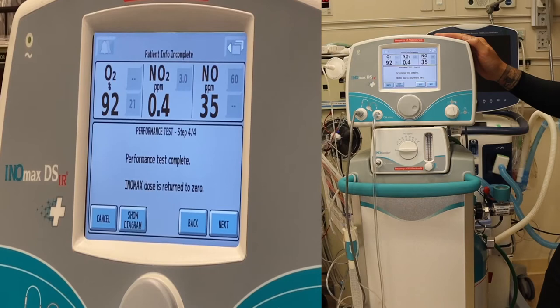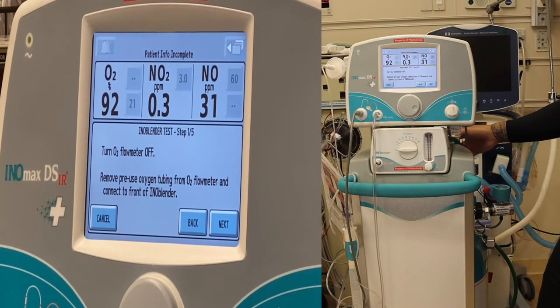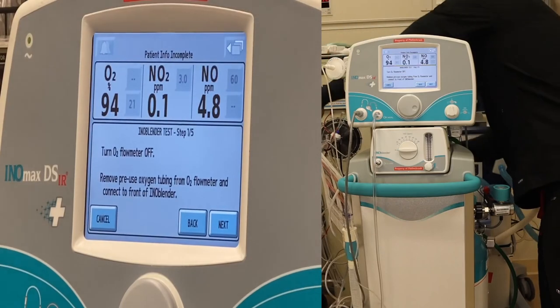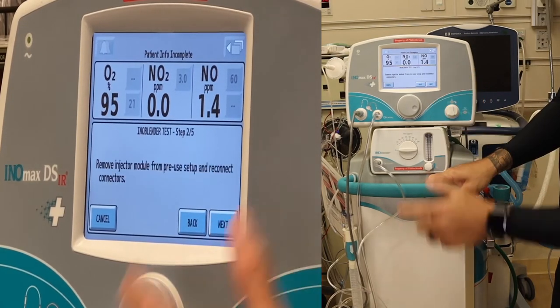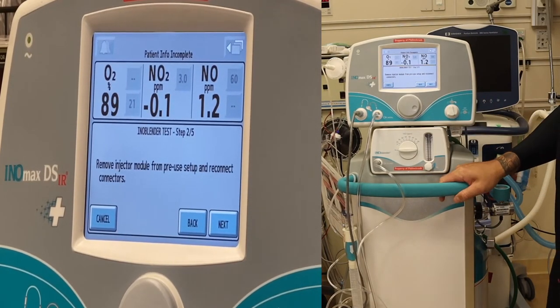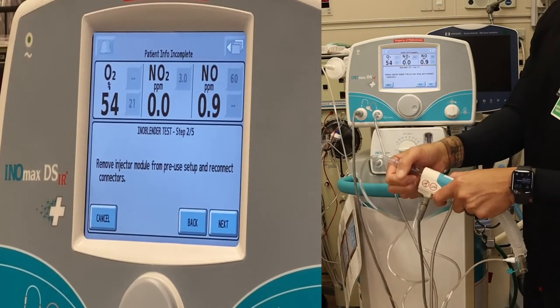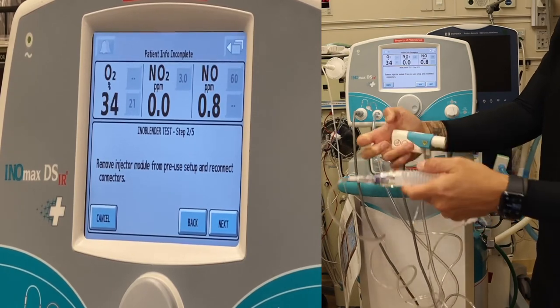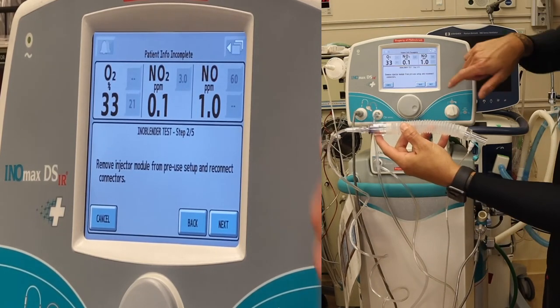Performance test is complete. The INO max will go back to zero. Turn off the O2 flow meter, remove the pre-use oxygen tubing from the O2 flow meter, and connect to the front. Turn that off in the back, go to auxiliary, and plug the O2 tubing into the blender in front. Press next. Remove the injector module from the pre-use setup — remove the O2 and corrugated tubing, place those together, removing the injector module. Press next.